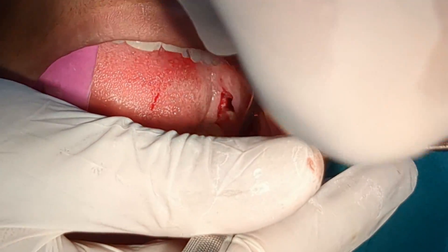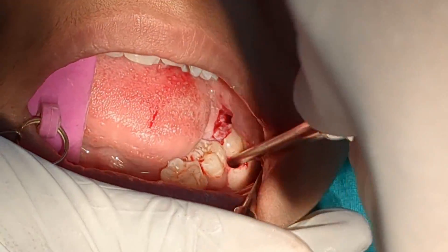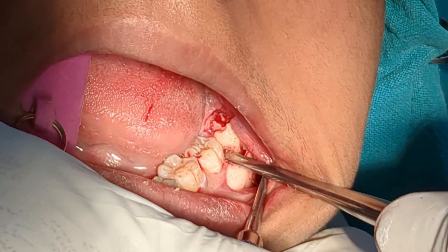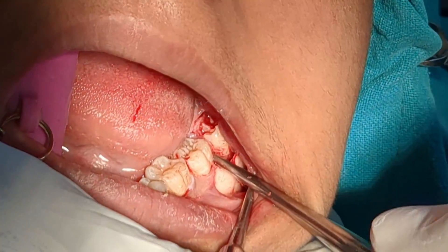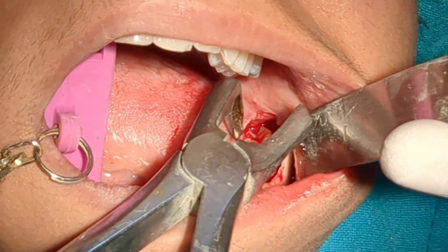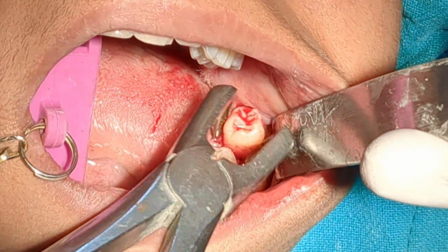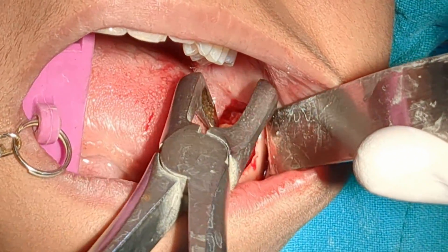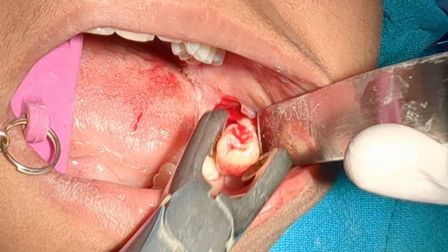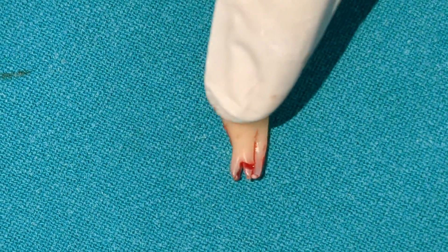I try to deliver the tooth out of the socket using the Copeland elevator, but the tooth is still getting stuck by the distal bone. As I have already cut enough bone distally, I use a third molar forcep to pick the tooth out of the socket. This is the extracted tooth.